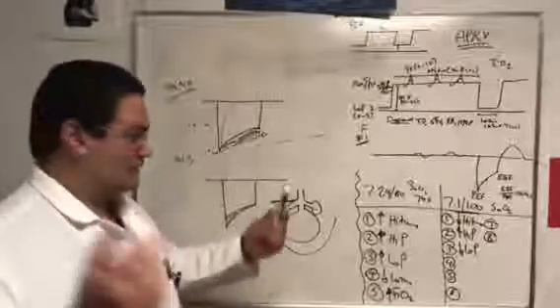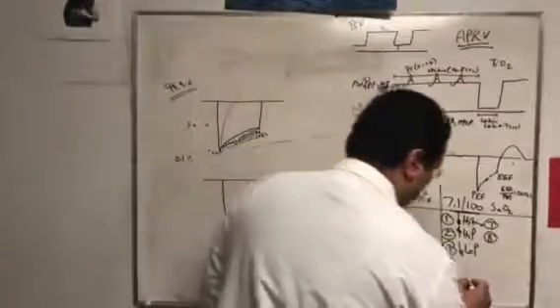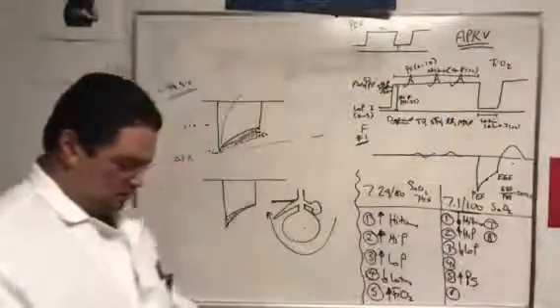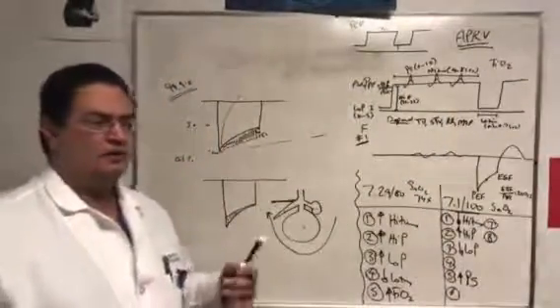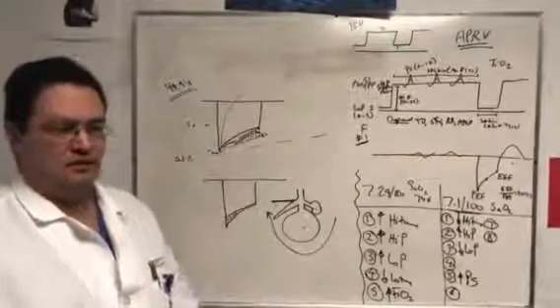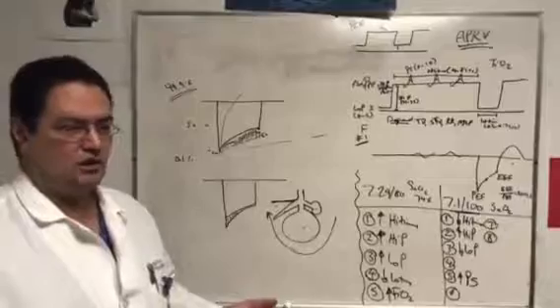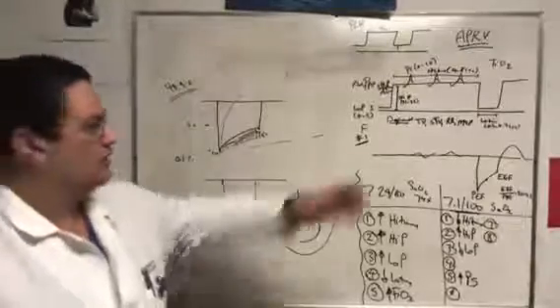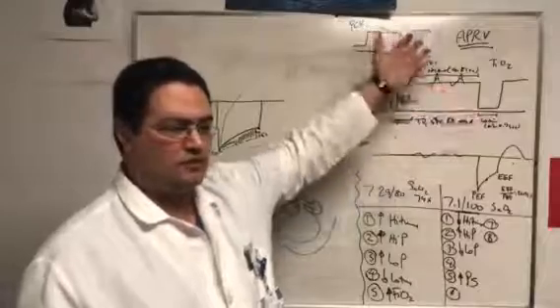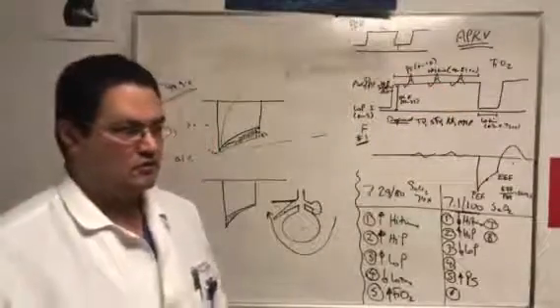Pressure support. Yes. So we'll increase the pressure support. That's number 5. This is all in order of preference, right? So increase the pressure support. Why? So increasing the pressure support is guaranteed to actually increase your minute ventilation by definition, right? You have small tidal volume here, 150 or something. You add tidal volume, becomes 250 each. That's it. You increase your minute ventilation, guaranteed.